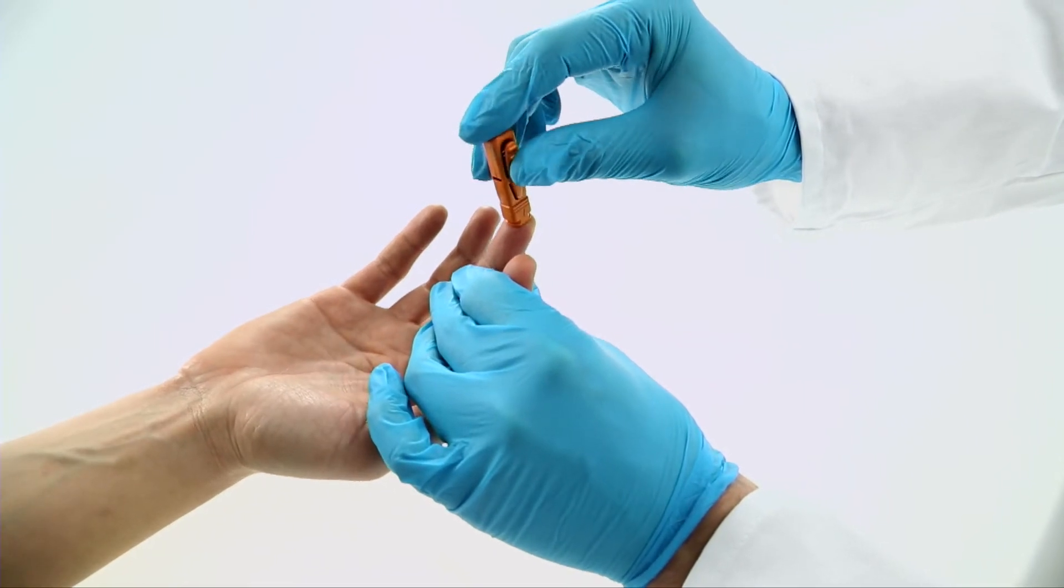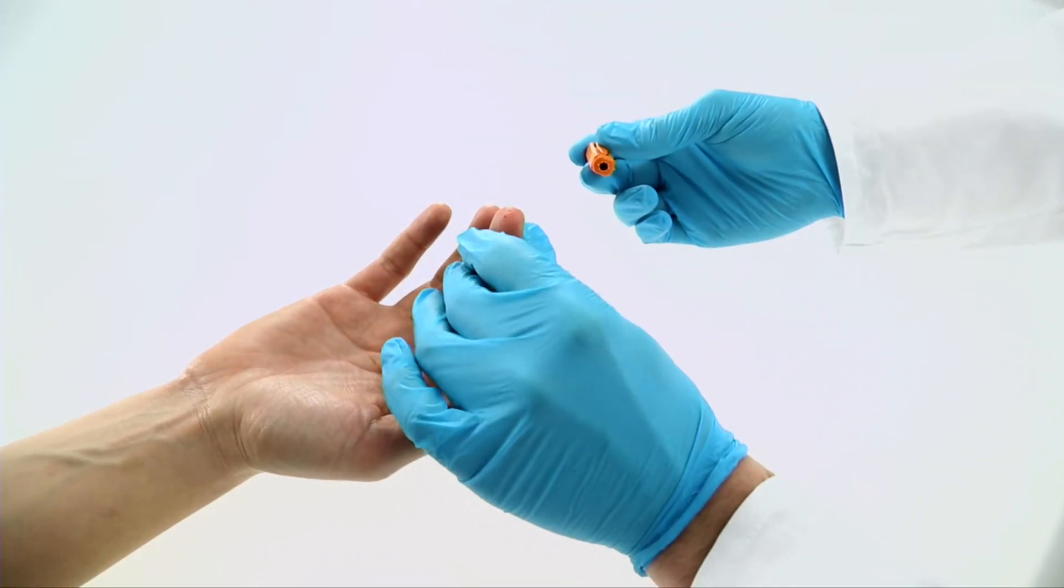If using blood obtained by finger stick, make sure not to use more than 100 microliters.